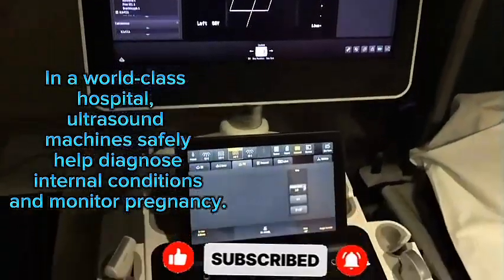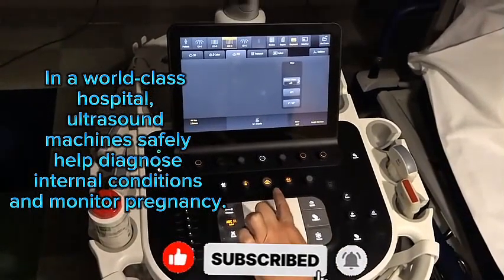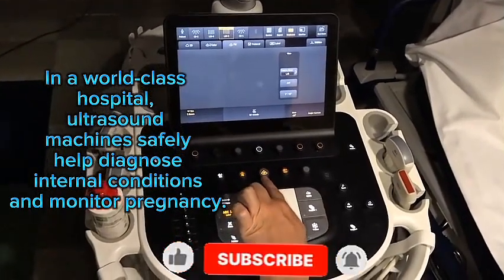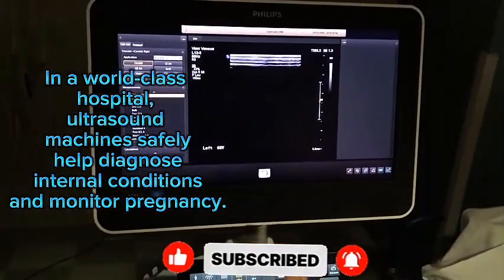You can turn all of that off and go straight back to grayscale simply at any point in time during any study by hitting the 2D button. You come back to grayscale instantly.